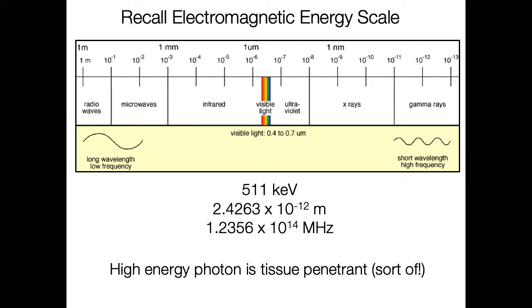And in between, we have the visible light spectrum. So overall, positron emission tomography is an ionizing radiation, but that also means that the photons that you can detect get emitted from inside the subject, penetrate the tissue and then reach the detector. And we're going to talk a little bit about this penetration through tissues as well, and what happens with that.